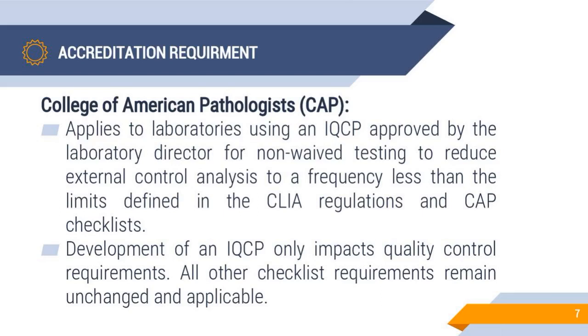The frequency could be more than 1 time a day, daily, weekly, whatever your manufacturer instruction asks you to do. If you are doing your test with less than 2 levels or less frequency than the manufacturer instructions, then you have to do IQCP.